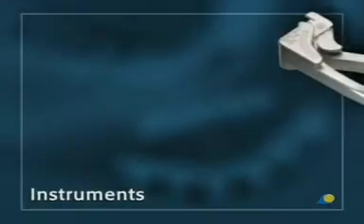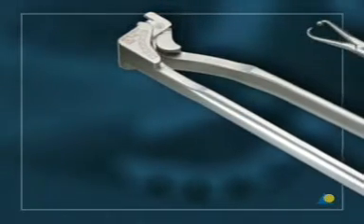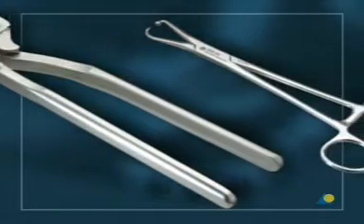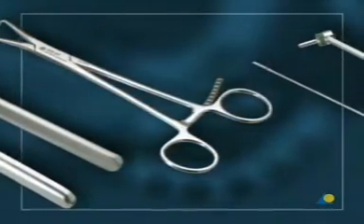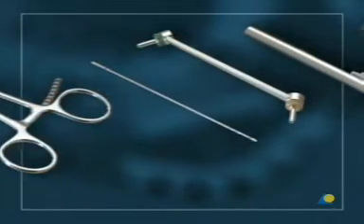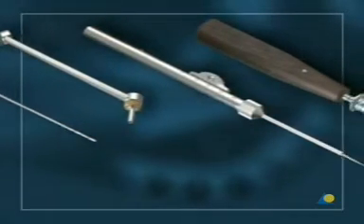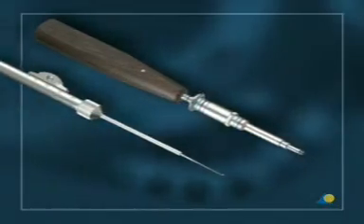The instruments needed for the universal fracture plate are the bending pliers with nose, the holding forceps with ball tip, the 1.8 millimeter drill bit, the LC-DCP drill guide, the depth gauge, and the 2.4 cruciform screwdriver with holding sleeve.